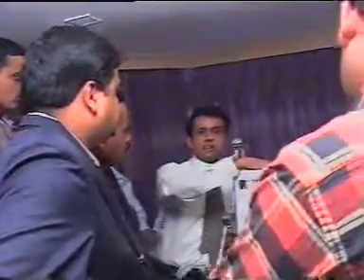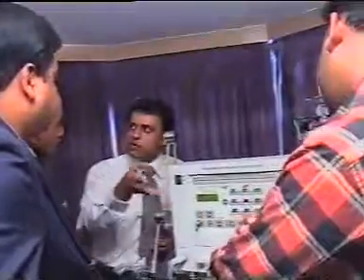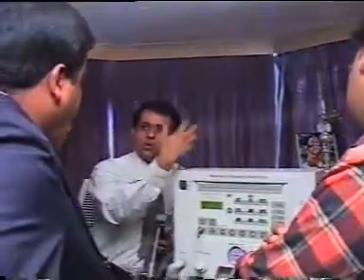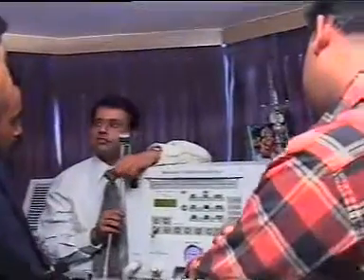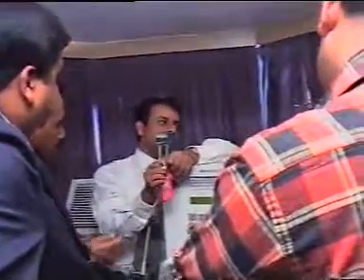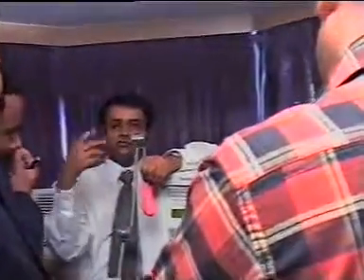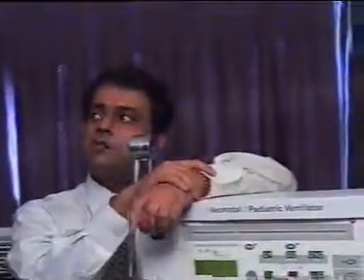Now we are concluding with the effects. Ultimately, what are you trying to do with the ventilator? Give in oxygen, give out carbon dioxide. So what happens when you change the settings? If you increase the FiO2, what happens to the oxygen? Let's say PaO2 increases. The relation between oxygen concentration, FiO2, and PaO2 is described by the rule of 7.